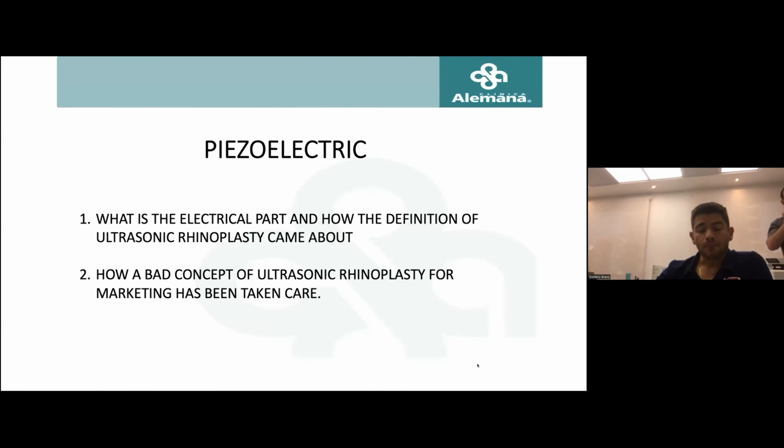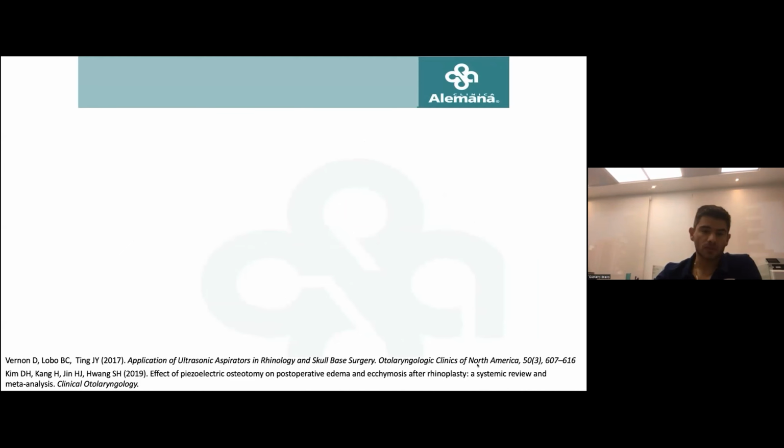And it's also very important to know that it's a marketing place, because it's not all the rhinoplasty that we do with the ultrasonic or with the piezoelectric. It's only two or three steps, and I will explain this.